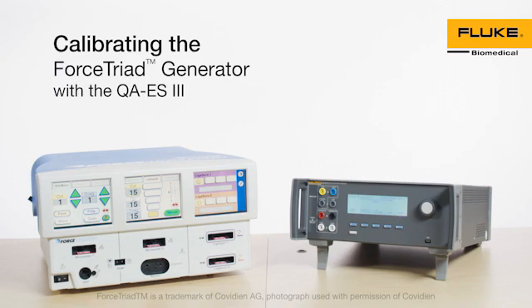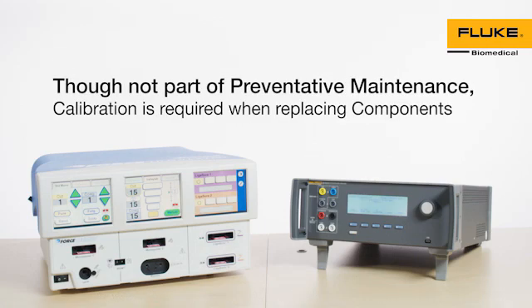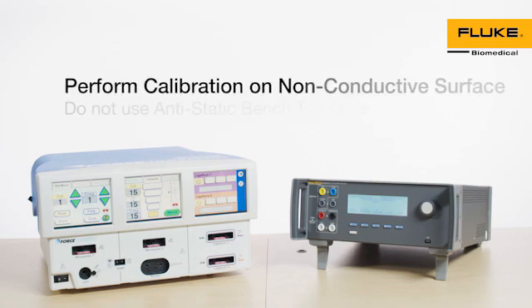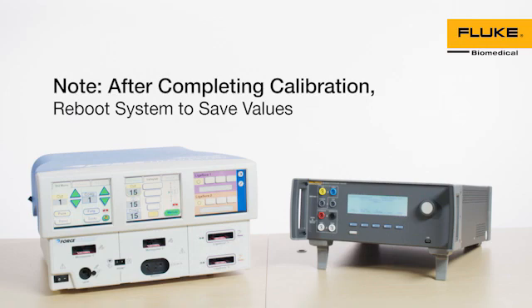You should calibrate the Force Triad before performing routine maintenance. While calibration is not part of preventive maintenance, it is required when components are replaced. Make sure the calibration is performed on a non-conductive surface. Do not use anti-static benchtop mats. After completing any calibration section, reboot the system to save the values from that calibration section. Calibration consists of 10 steps.